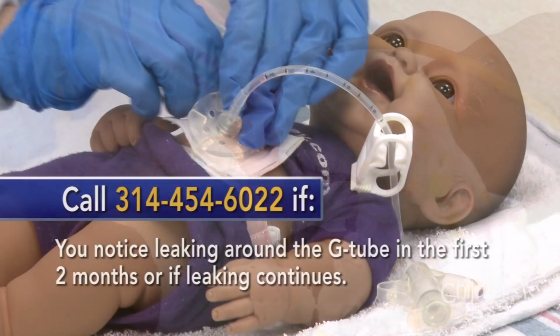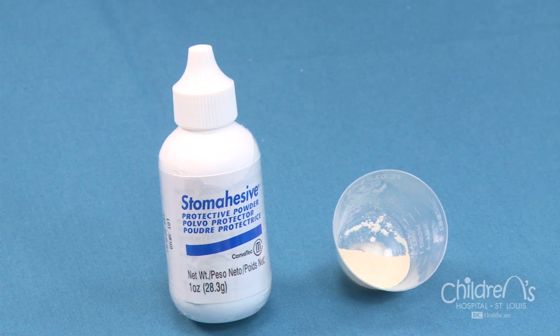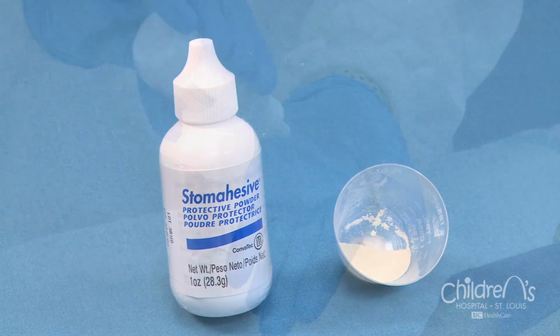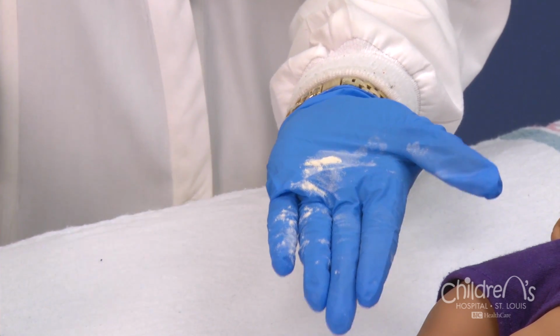If you notice leaking around your child's G-tube and your child has had the tube for less than 2 months, or if leaking continues, please call the surgery office. However, here are some helpful tips. When stomach secretions leak onto the skin around the gastrostomy appliance, it can be very irritating to the skin and cause it to break down or turn red. Several products are available to help protect your child's skin. Stomahesive is the most commonly used powder to help absorb some of the drainage while protecting your child's skin. Here's how to apply it.